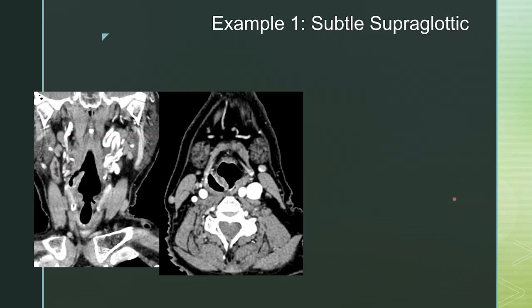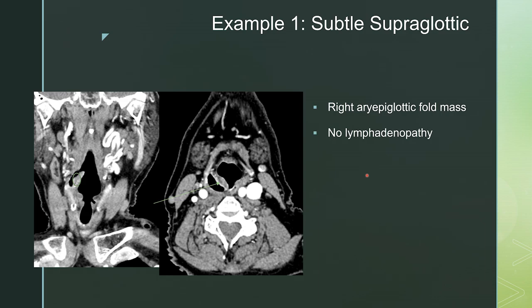Our first example: take a look at these coronal and axial images. You can see that this aryepiglottic fold is nodular and thickened on the coronal view, and nodular and thickened on the axial view as well. So we have a right aryepiglottic fold mass, no lymphadenopathy on these images, distant mets not assessed — this is a T1N0MX supraglottic cancer.